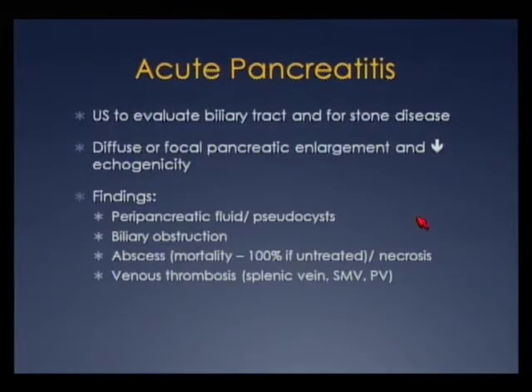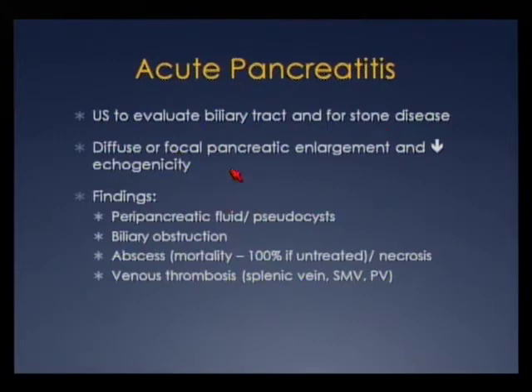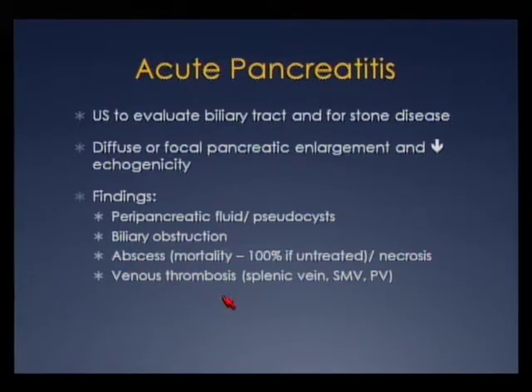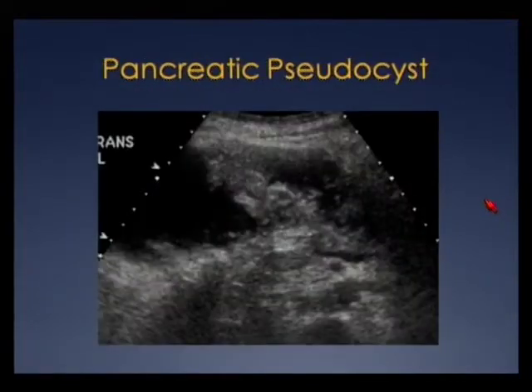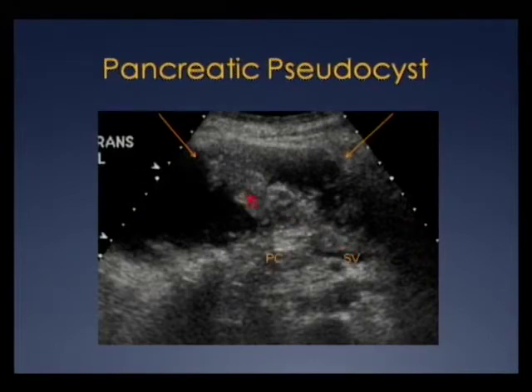Knowing midline anatomy is critical for assessing abdominal pathology. For acute pancreatitis, we don't use ultrasound for direct evaluation — CT is used — but we use ultrasound to evaluate the biliary tract for possible stones such as in gallstone pancreatitis. If we see the pancreas, it may be diffusely or focally enlarged with decreased echogenicity. We also look for peripancreatic fluid, pseudocyst formation, biliary obstruction, pancreatic abscess, and vascular complications. Here's an enlarged boggy hypoechoic pancreas in a patient with acute pancreatitis, and another case with a large complex fluid collection with debris — a pancreatic pseudocyst.